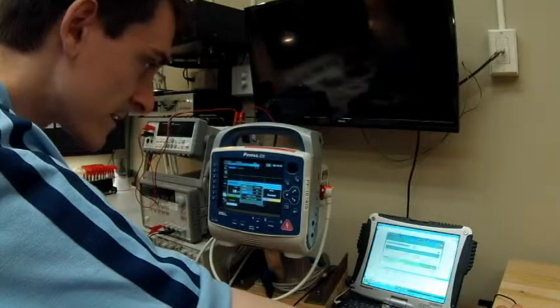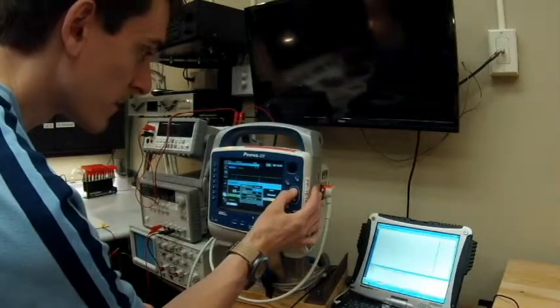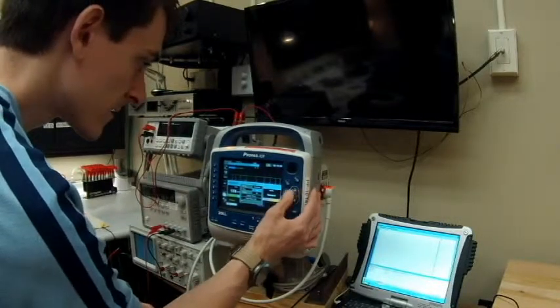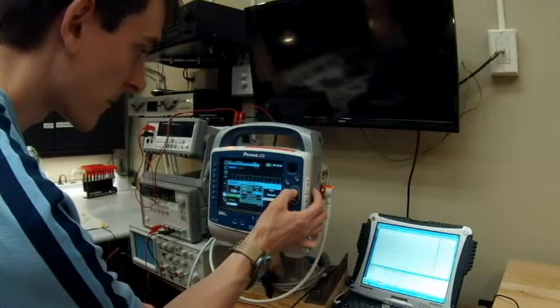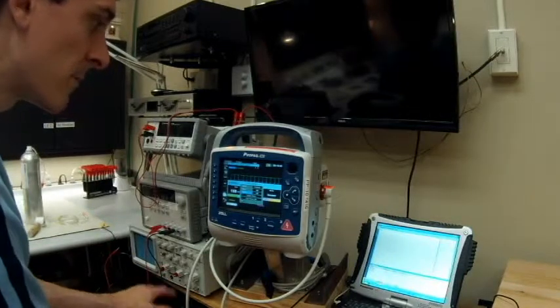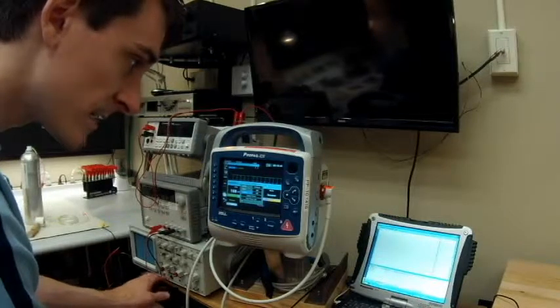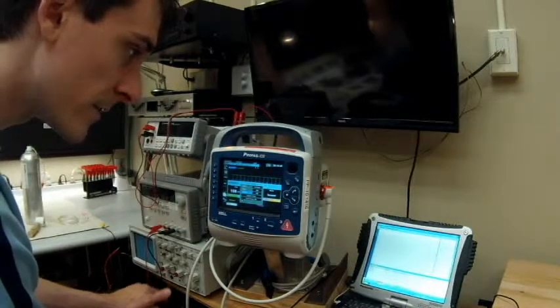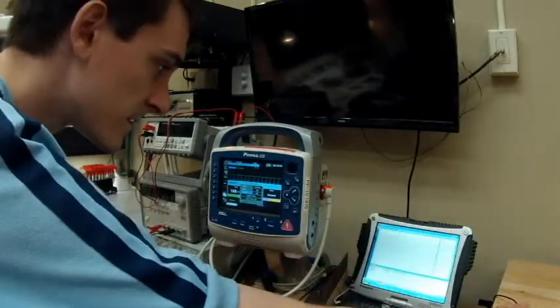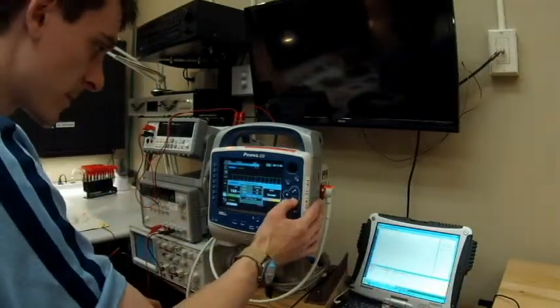The next pacer test is at the maximum settings. The rate is going to be 180 beats per minute and the output 140 milliamps. We're getting 179.6 out of 180 for rate, and 143.1 milliamps for output — both fall within the acceptable standards. The test passed, so we're going to turn off the pacer.